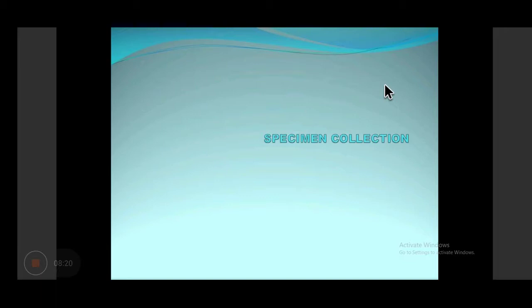When you suspect anaerobic infection, what specimen will you collect? Never a swab, yeah. Biopsy, base of lesion, any aspirated fluid. How will the specimen come, in a wide-mouth container or in a syringe? Fluid. Okay, tap. Okay.